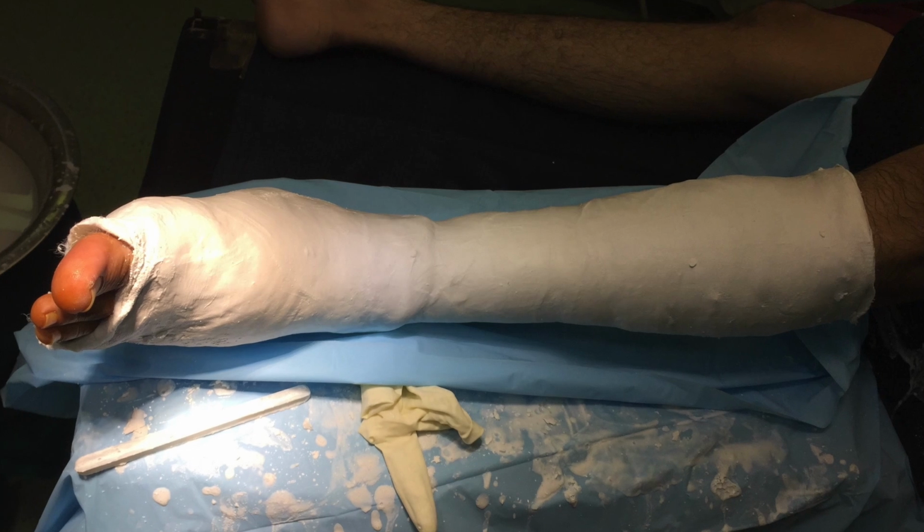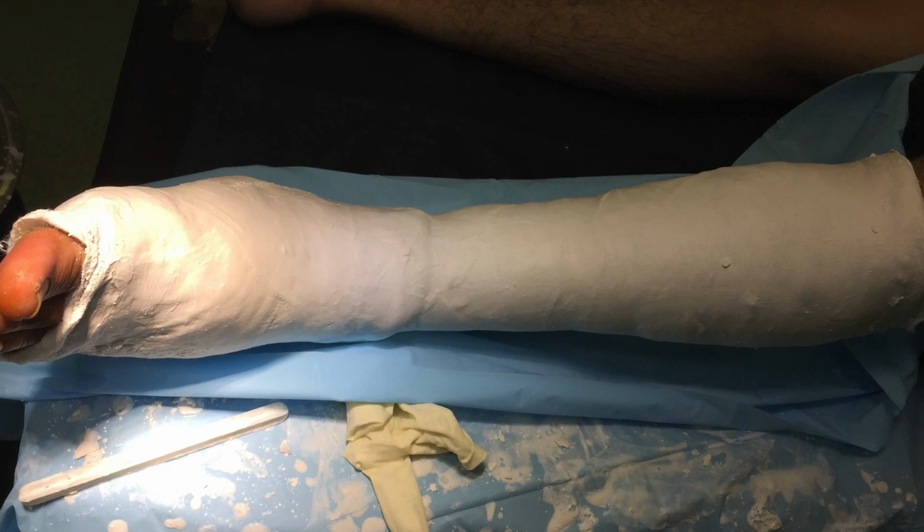So this is the position of the cast that is being applied.